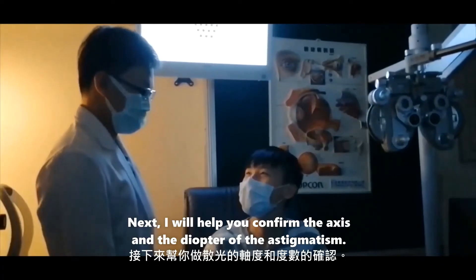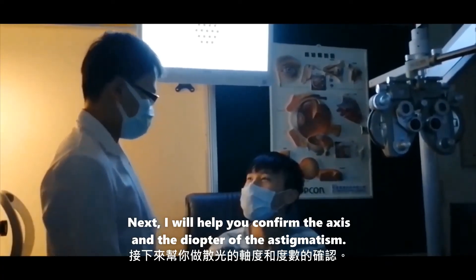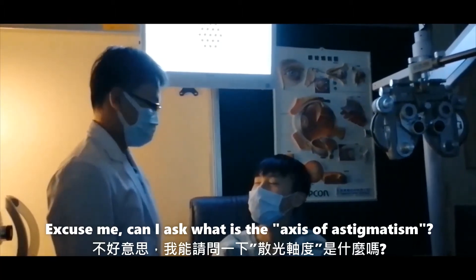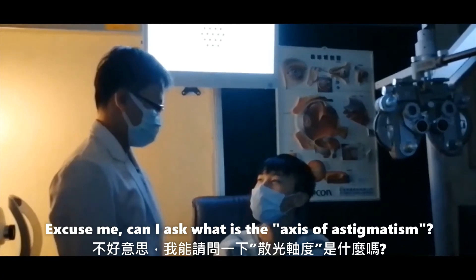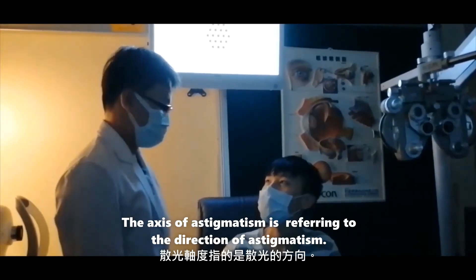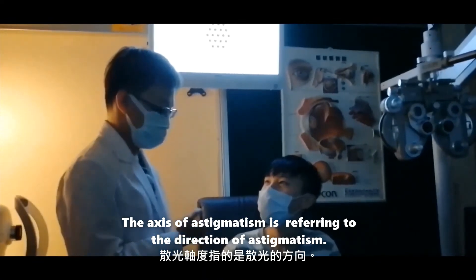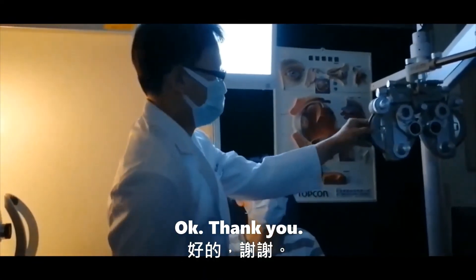Next, I will help you confirm the axis and the diopter of the astigmatism. Excuse me, can I ask what is the axis of astigmatism? The axis of astigmatism is referring to the direction of astigmatism. Okay, thank you.